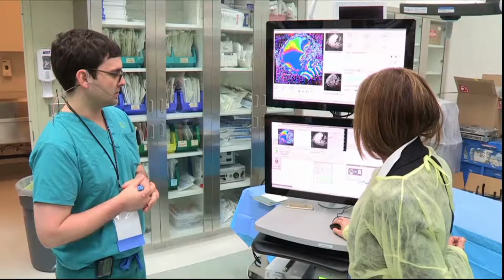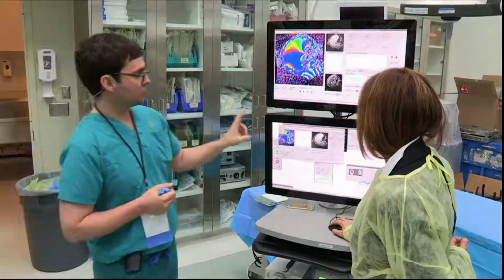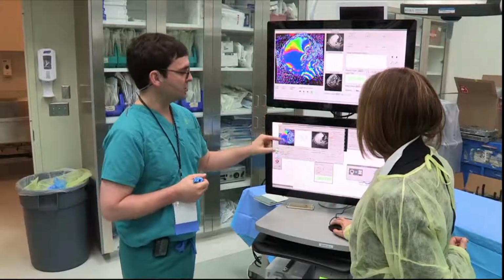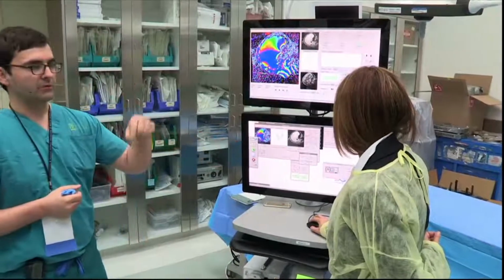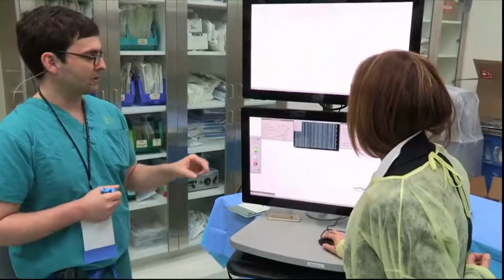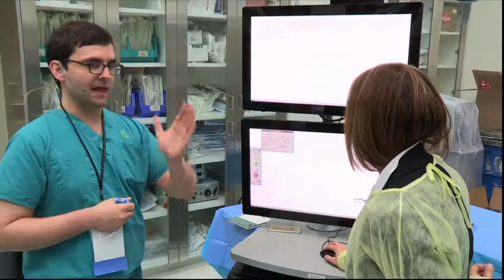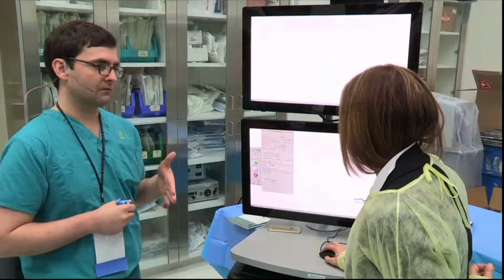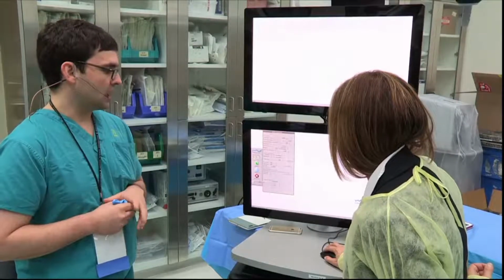A little bit of what we talked about before, you're going to choose two images, one in the sagittal plane. Certainly if you're doing hypothalamic hamartoma, you can do it in the coronal. You're not going to move the catheter. But when you're doing the hippocampus, you want it in the axial and sagittal plane along the whole length of the catheter, so you're not having to choose other images.